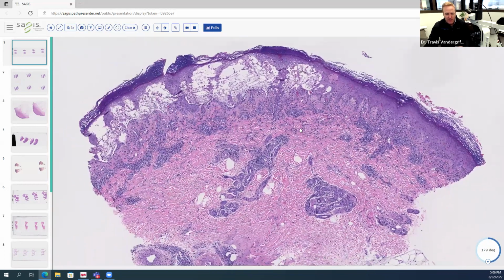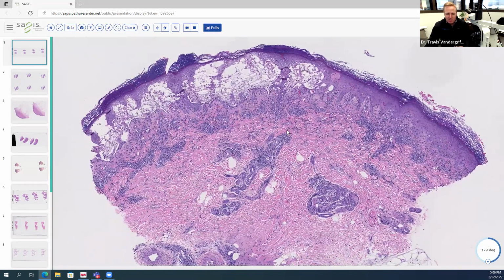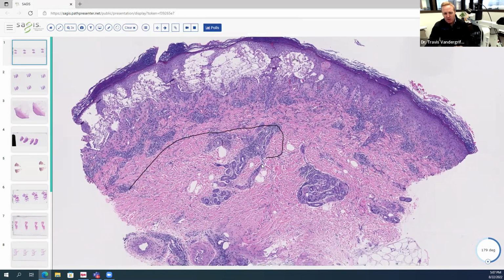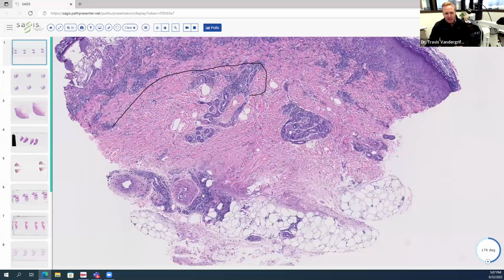In the differential diagnosis with erythema multiforme, another clue that this is fixed drug rather than EM is that the infiltrates are involving the mid-dermis as well. In erythema multiforme, you have a superficial process, but the mid-dermis tends not to be inflamed. So the fact that these infiltrates are also extending into the mid and deep dermis on scanning suggests fixed drug eruption over erythema multiforme.